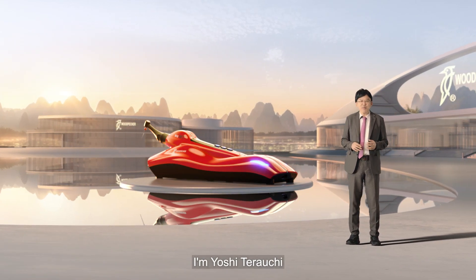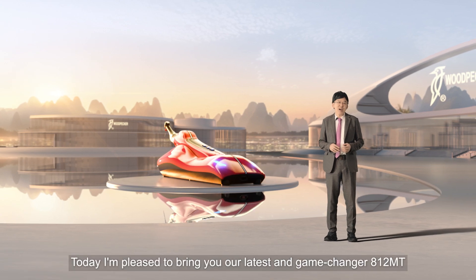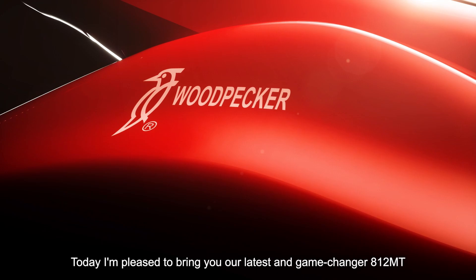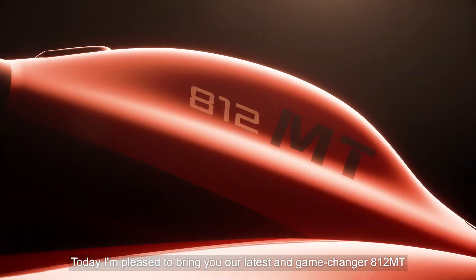Dear friends, I'm Yoshi Terauchi. Today, I'm pleased to bring you our latest and game-changer, the 812 MT.